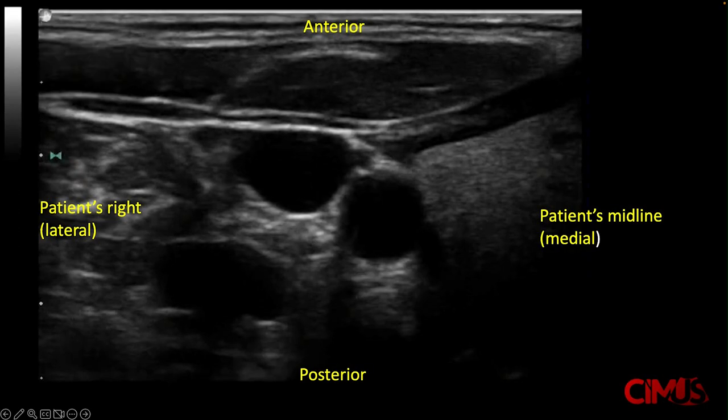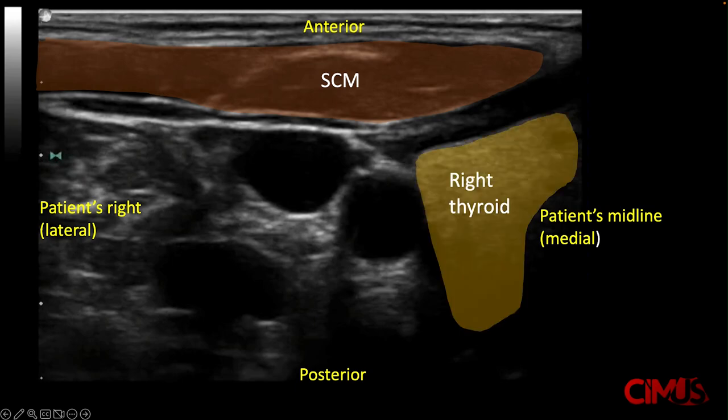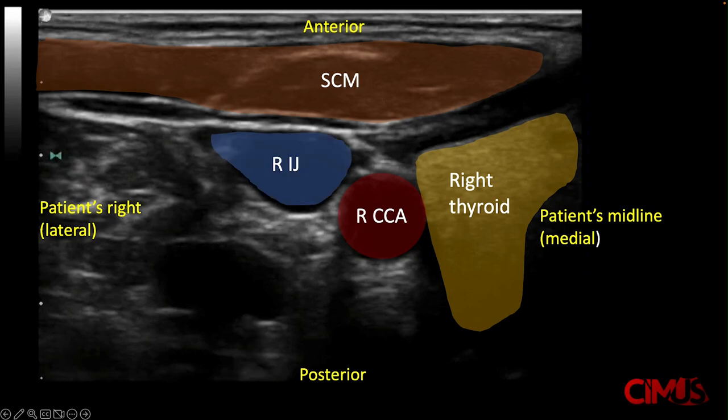Anatomy-wise, anteriorly you will see the sternocleidomastoid muscle. Near the midline, you can see the patient's right thyroid lobe. Lateral to that is the right common carotid artery, and lateral to that should be the right internal jugular vein.